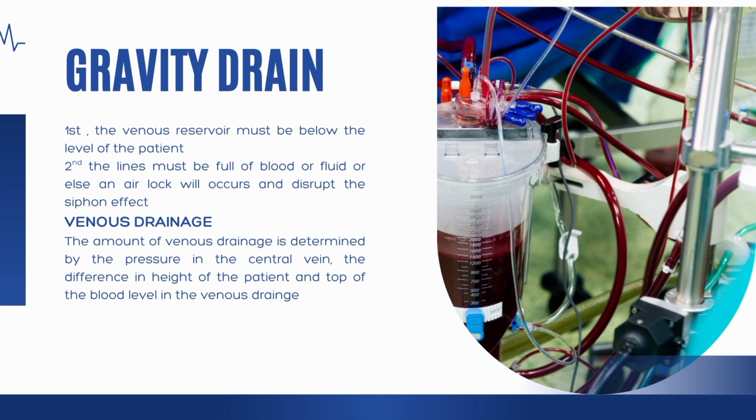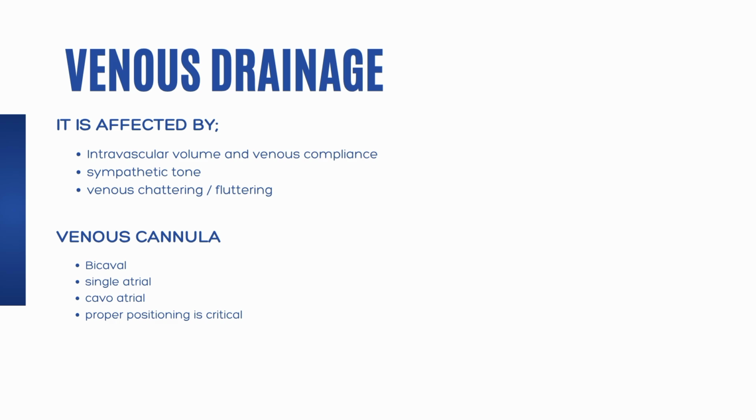The factors affecting venous drainage. The efficiency of the drainage depends on the CVP, the central venous pressure, and the height difference between the patient and the reservoir. Resistance in the cannula also matters.